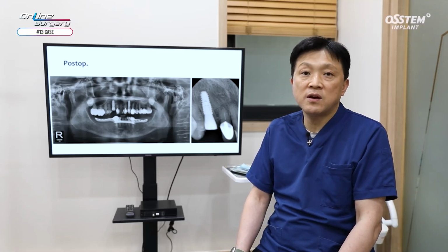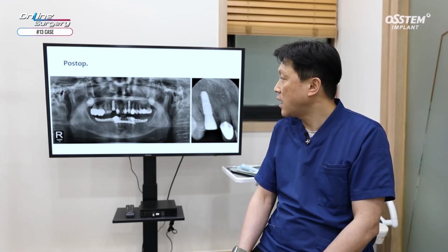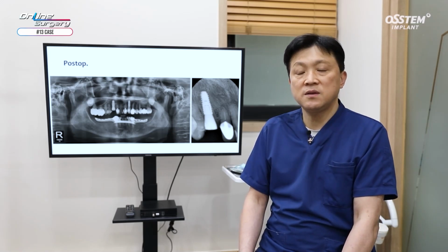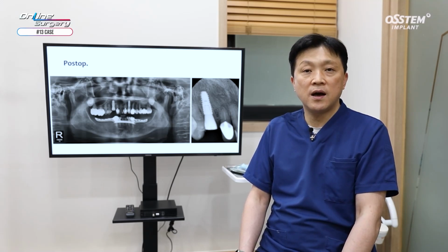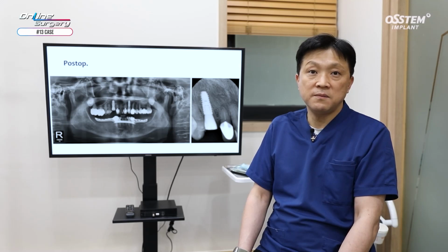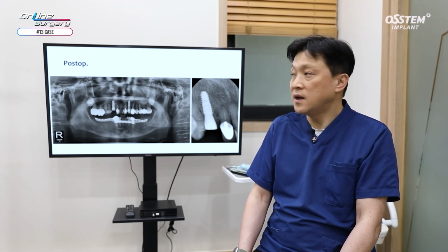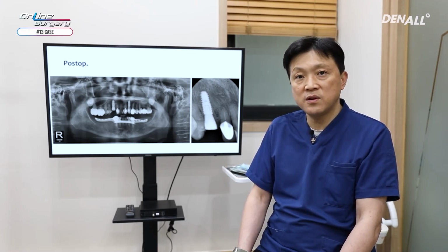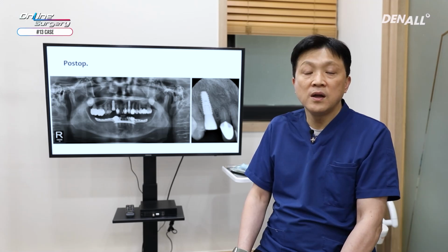KS3 4.0 by 10 mm implant was used. In the case of upper anterior, your choice of implant diameters is quite limited. If you use a KS implant with such deep connection, then stability between the implant and abutment increases, therefore there is less possibility of screw loosening.